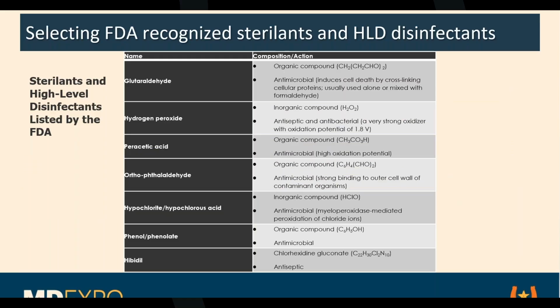So there's a lot of this interaction going on, a lot of Venn diagrams being drawn up saying who's responsible for what. But ultimately, once it's inside the hospital, I submit that the HTMs are extremely important in guiding how it's used, making sure that it's being used properly, making sure that it's getting the right treatment when it needs to be repaired, etc.